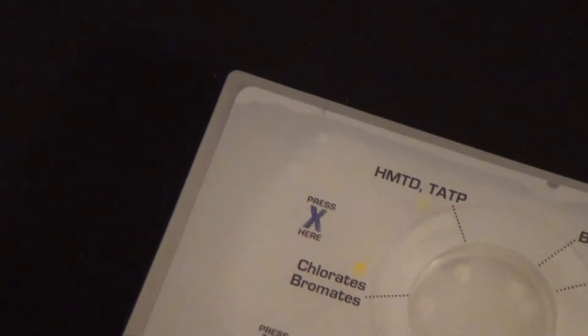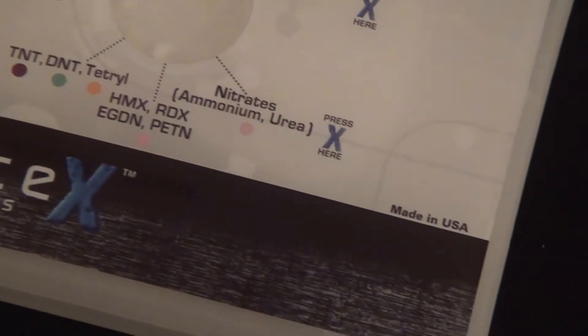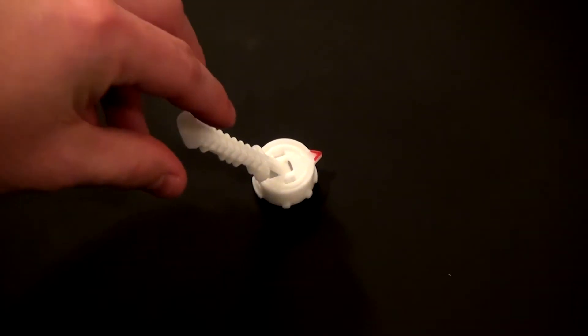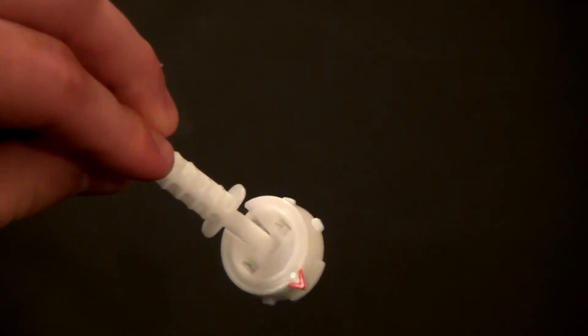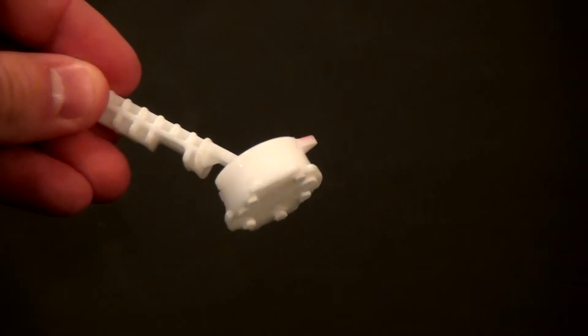One common source of contamination is gunshot residue on the user's hands, if the user recently fired a gun. With other kits, the user touches the wipe while conducting a swab. As a result, if the user's hand is contaminated, the sample will likely be contaminated. The TRACE-X collector, on the other hand, has a built-in cover which protects the kit from contamination from the user or from the environment.